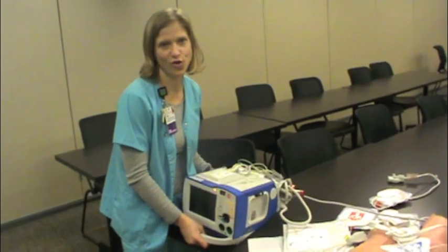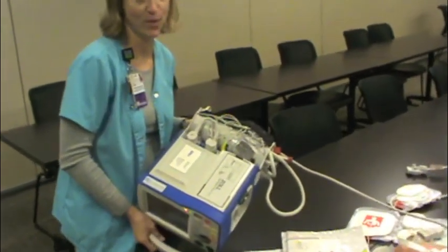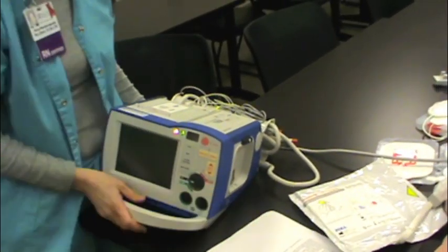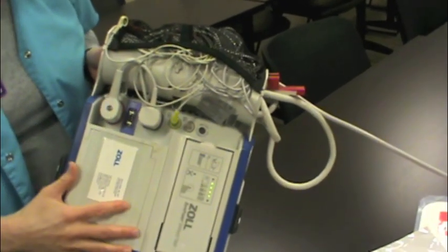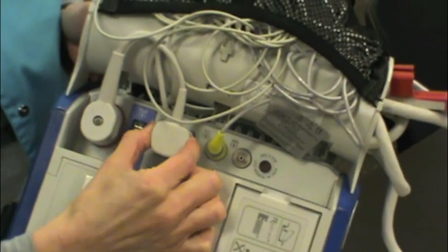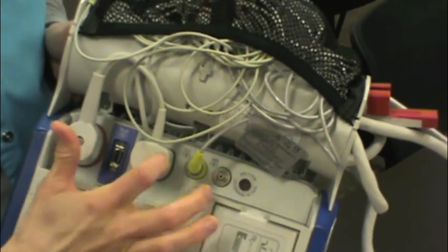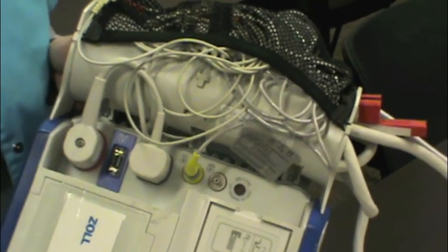This is our new Zoll R-series defibrillator, and we're giving you a quick overview. On the top, you'll notice three cords. This one is the one that delivers the joules. This is the EKG cable, and this is for capnography. These three cords will always stay with the machine — they're not disposable. Just keep them plugged in.